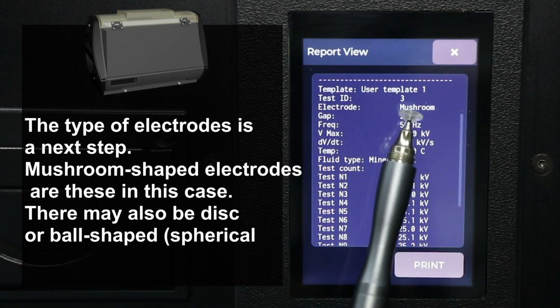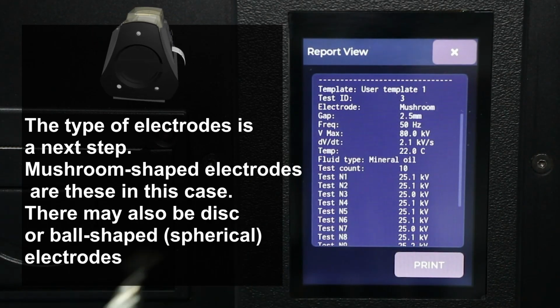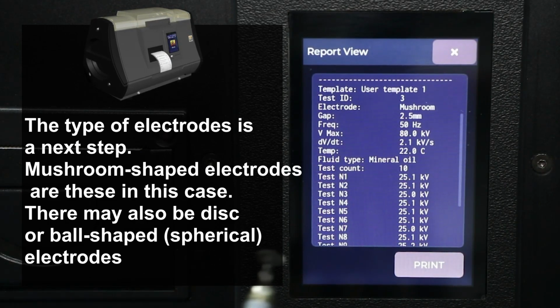The type of electrodes is the next step. Mushroom-shaped electrodes are used in this case. There may also be disc or ball-shaped, spherical, electrodes.